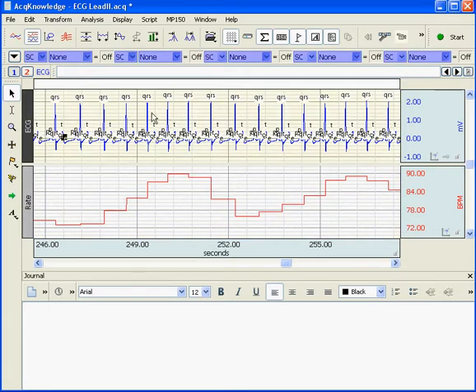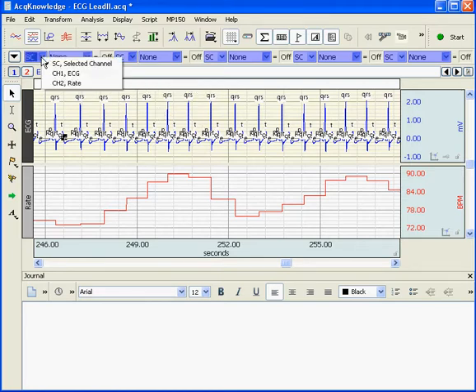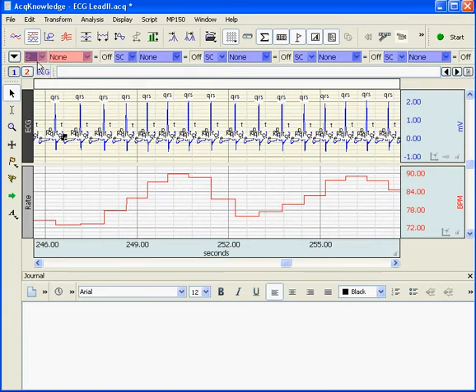If I move to the top, you can see our measurement boxes are now blue and channel 1, the raw ECG, is now the selected channel. If I want to take a measurement from channel 2, I can define this measurement as coming from channel 2.